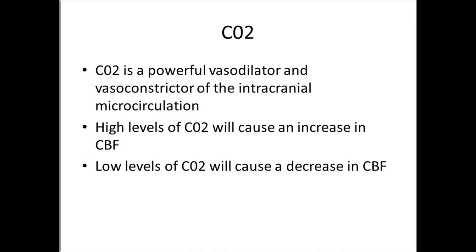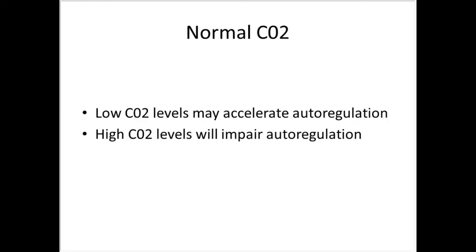Now, CO2 is a powerful vasodilator and vasoconstrictor of the intracranial microcirculation. High levels of CO2 will cause an increase in cerebral blood flow, and low levels of CO2 will cause a decrease in cerebral blood flow. If it's available to you, it's good to know what your patient's CO2 level is, whether it's an end tidal or even a blood gas level, because low CO2 levels may actually accelerate cerebral autoregulation, and high levels of CO2 will impair cerebral autoregulation.